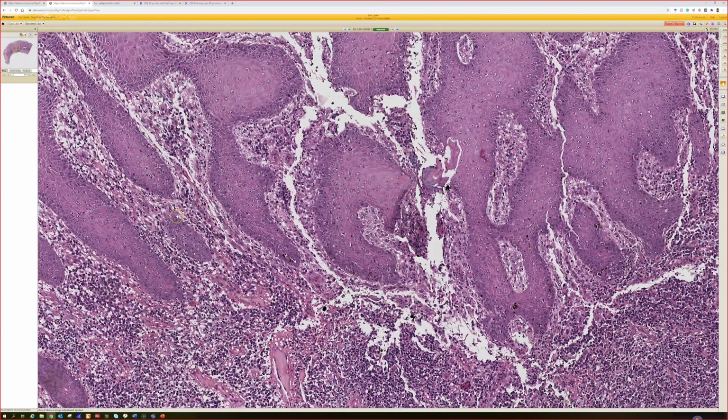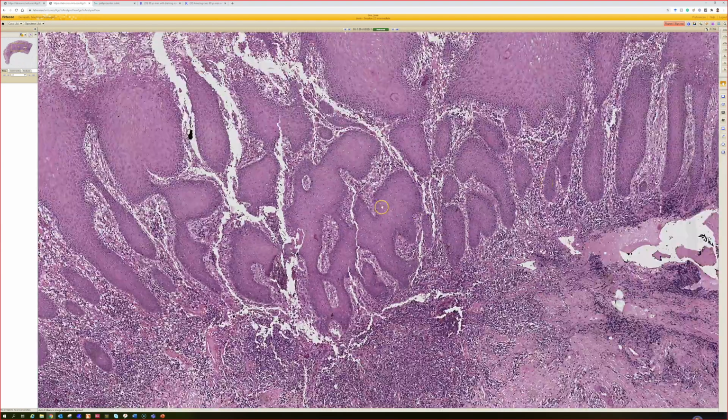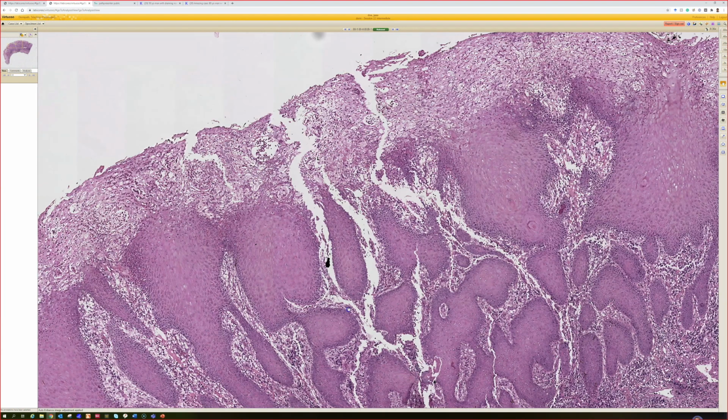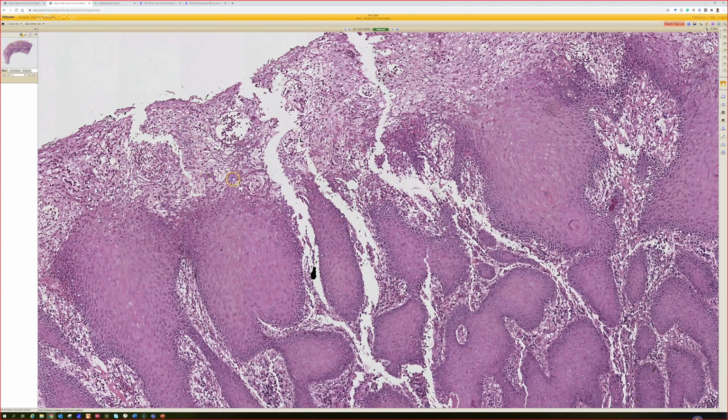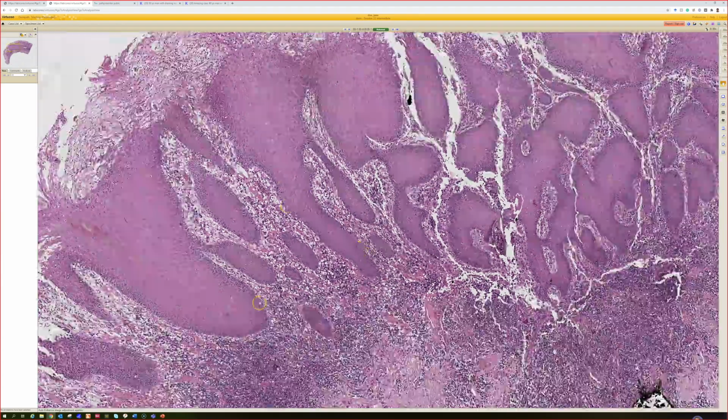And you're right, this is mucosal. This is probably perianal would be a good site, or genital skin. So then what did you think, or what would your differential be? So a differential for the top part, I wanted to see if maybe there was candida hiding in there. Excellent. But I don't think that would explain everything. And then also, I know we always have to think about syphilis with these elongated rete and then plasma cells. Excellent. That was somewhere in there.